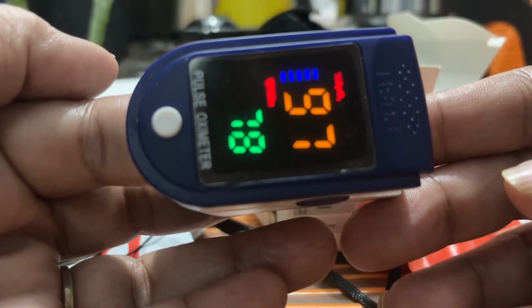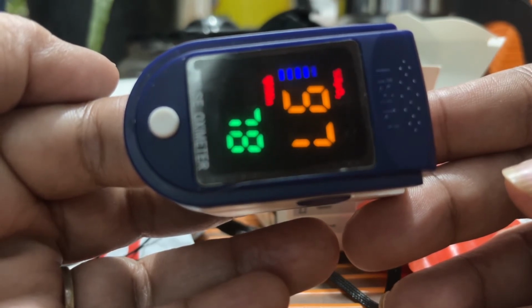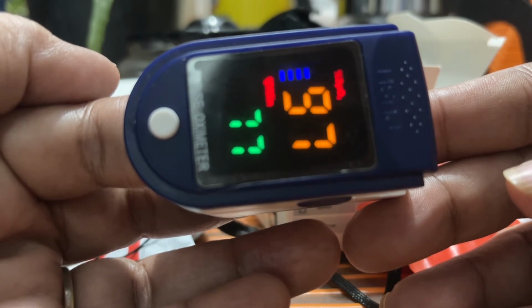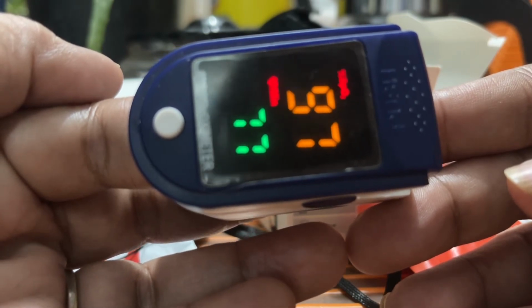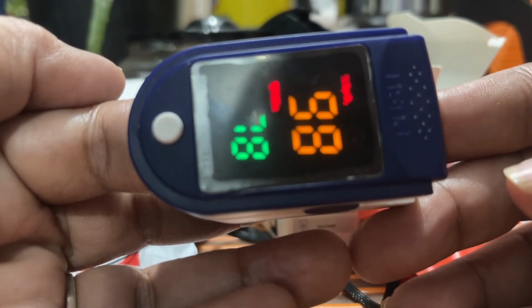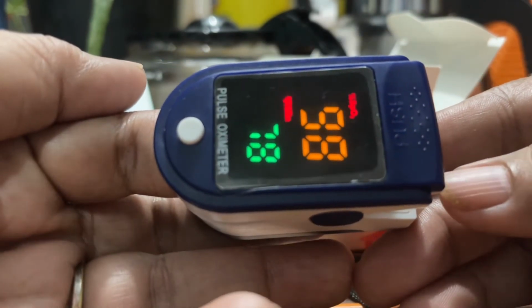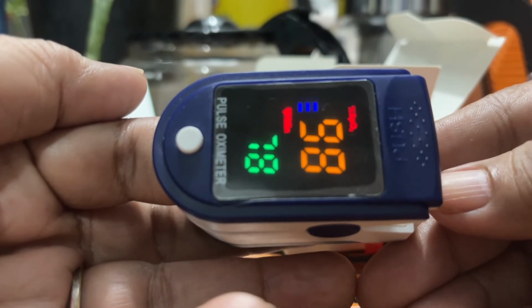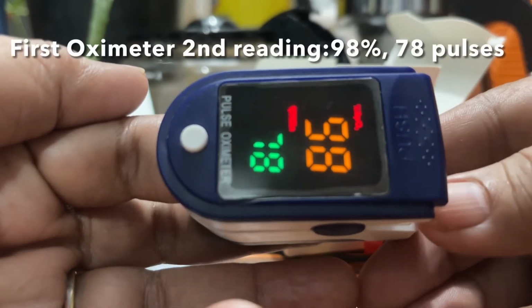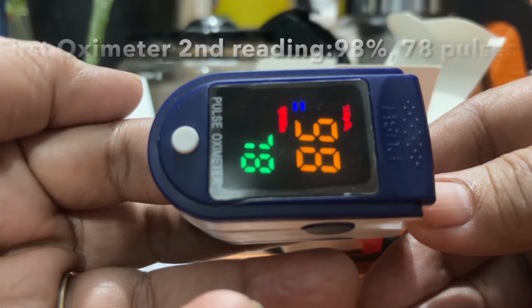From medicinenet.com, Dr. Richard Leviton, an MD, says that the use of home finger pulse oximeters by patients with COVID-19 could preempt the precipitous oxygen desaturation that leads to a crisis that needs intensive care. Pulse oximetry is a quick, non-invasive test that measures the oxygen level, oxygen saturation, in the blood. It is an easy, painless method to measure how well oxygen is carried to parts of the body farthest from the heart, such as the arms and legs.